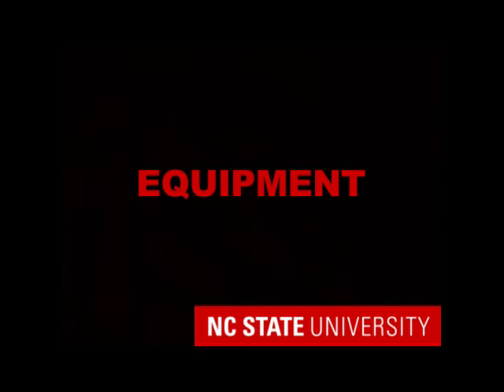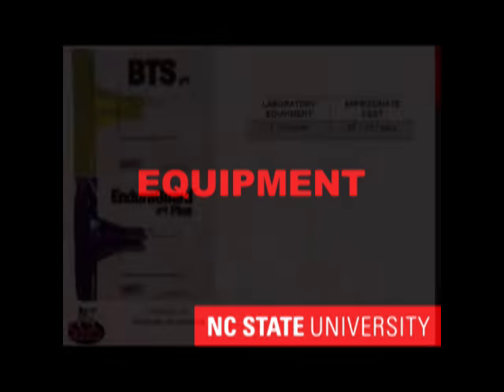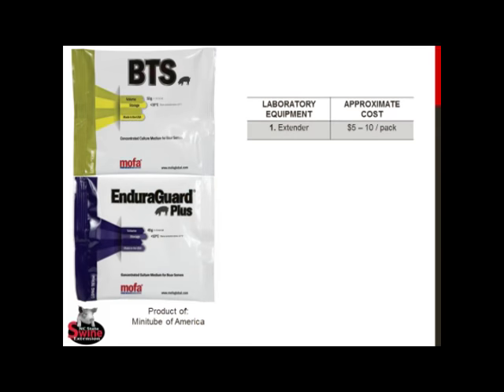Before getting started, we need to make sure we have the necessary equipment in place. The semen extender is what will ultimately be added to the semen to dilute the sample into multiple doses and preserve shelf life. There are many brands of extender available for purchase, and producers can best decide whether they will need a short-term extender, which will generally preserve semen for up to 3 days after collection, or a long-term extender, which may allow storage for up to a week or more.